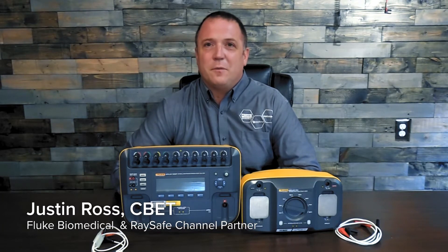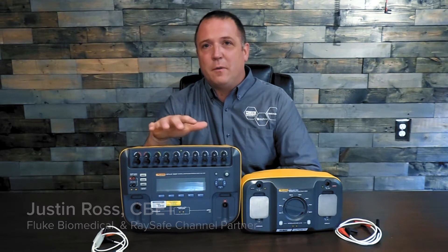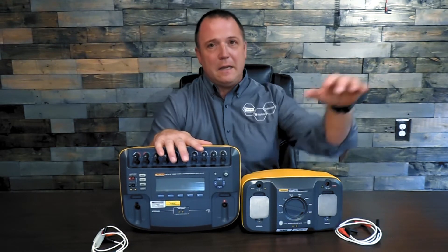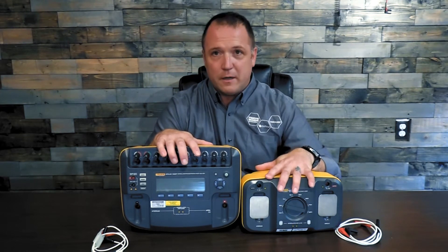Hello everybody, I'm Justin Ross with Fluke Biomedical and I'm here with two of our devices. One you might be more familiar with — our Fluke Biomedical Impulse 7000 defibrillator analyzer — and this one maybe not so familiar with, our Fluke Biomedical 7010 load box.